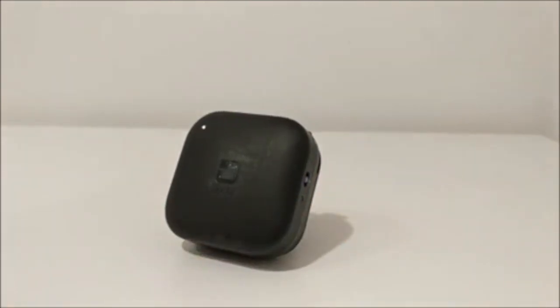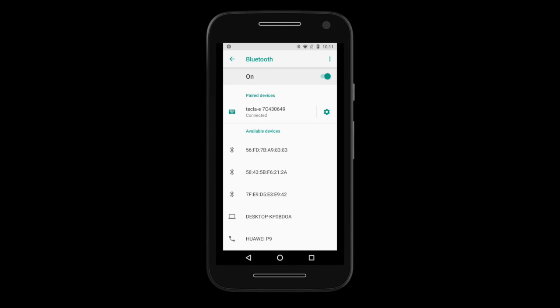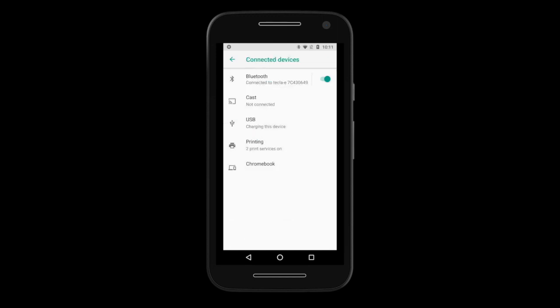You will hear a beep and the indicator light will turn an amber color. This is the way you will know your Tecla E is connected. The Tecla E will then appear in the list of available devices. If you don't see the Tecla E listed, you can tap on the 3 vertical dots in the top right corner and select Refresh.